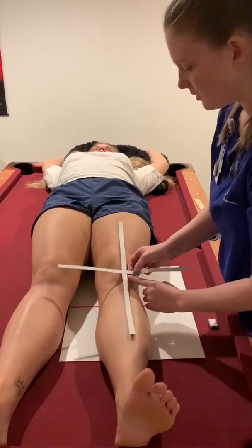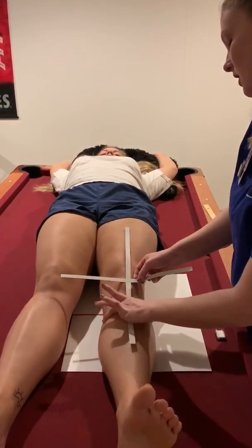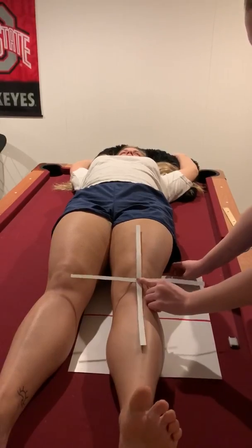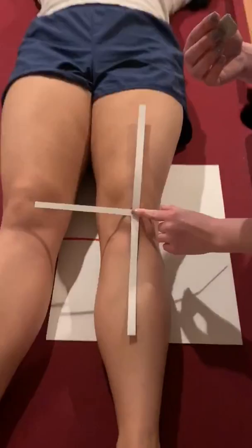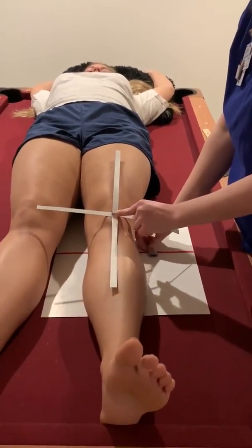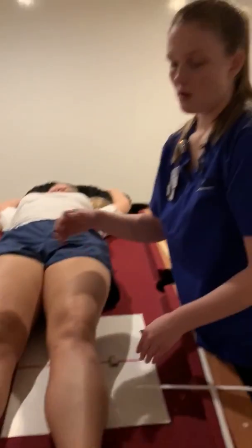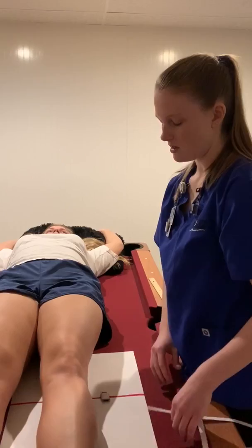And then I want to go in between her medial and lateral aspects of the knee. So I'd go about right here. So this would be the centering, and this is all lined up. And then I'm going to place the left marker on the outside, or lateral, to her knee right here. And you're going to want to collimate to 10 by 12 lengthwise for the knee.